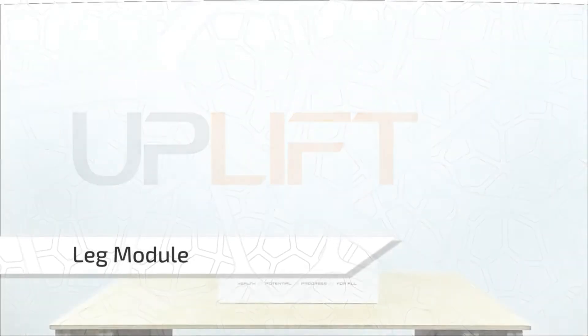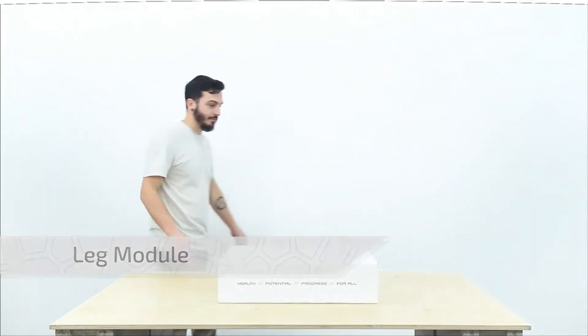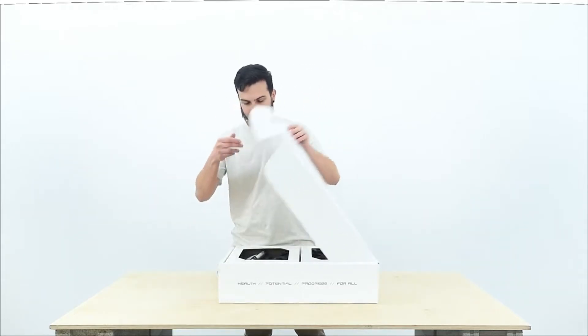Welcome! In this video, we'll take a look at the Leg Assistance Module of the Uplift Exoskeleton, exploring its functionalities, adjustments, and usage.